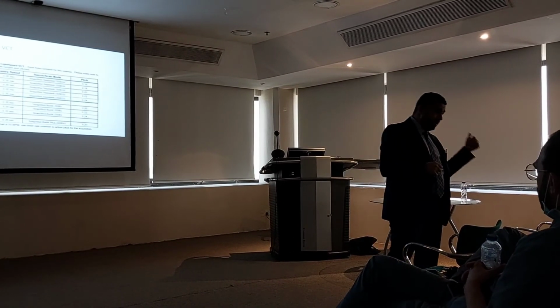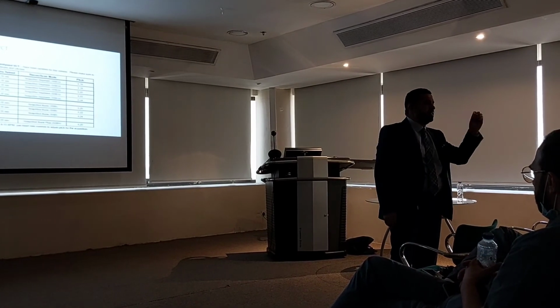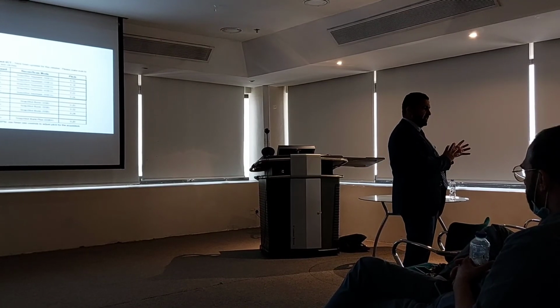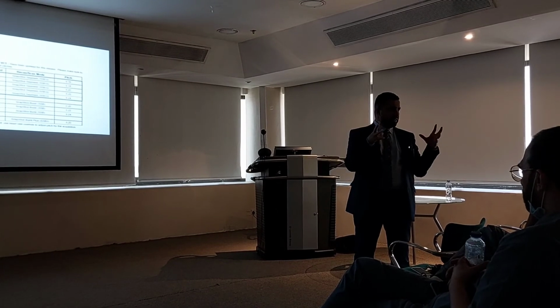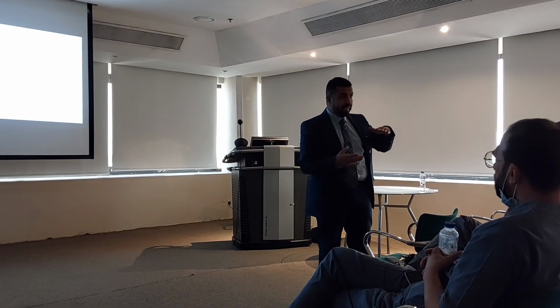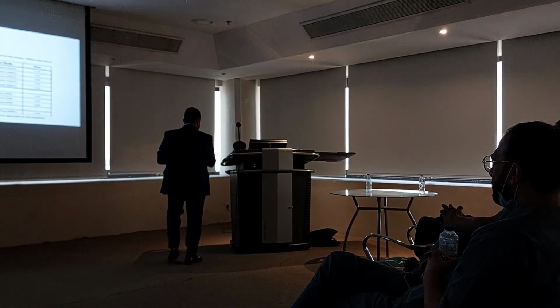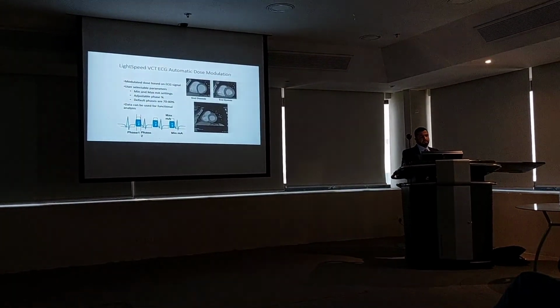If I did it without this, it will consider the wrong pitch, and that's really a very bad metric, because the pitch is not the best. The heart rate determines how fast I will be able to get the data, so one part of it with the helical is the pitch. It's very critical for your patient. Okay? I have another way. I will show you later with the machine.